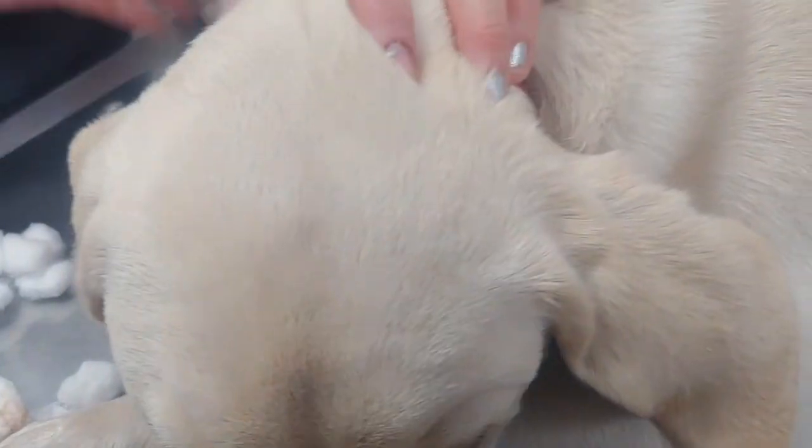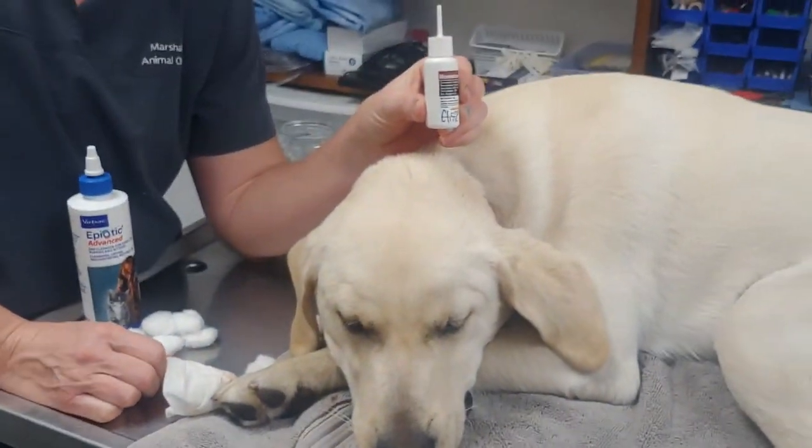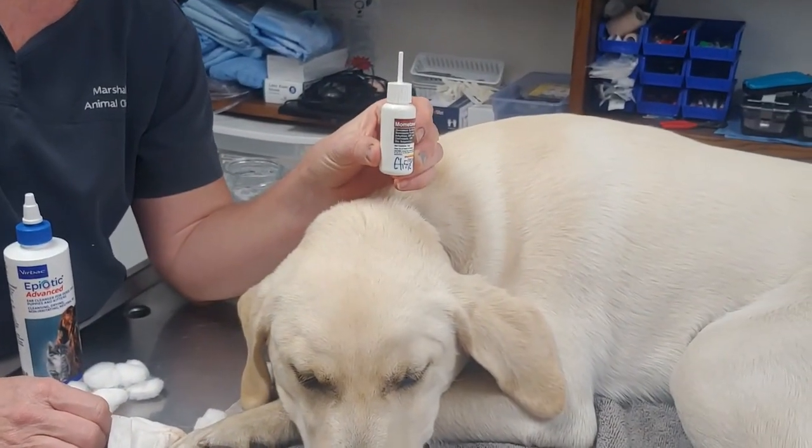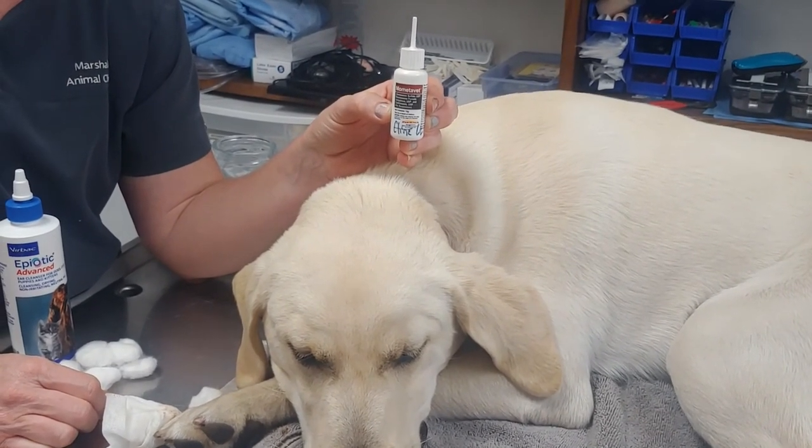I'm also going to demonstrate how to medicate with a long-tipped ear med. Most of our ear medications are going to have long tips, and people worry that the tip is going to hurt the eardrum. I promise it's not.